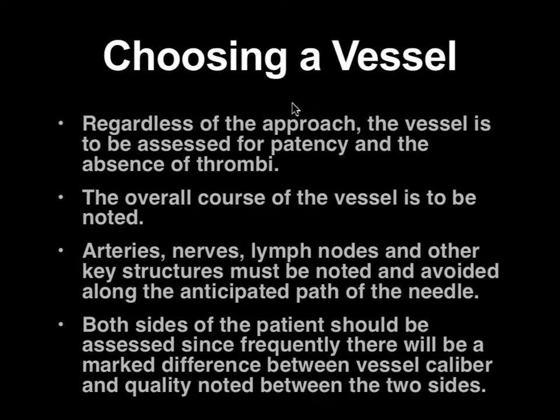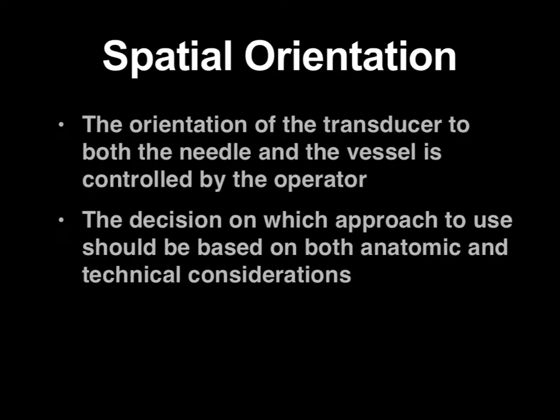Remember, assess both sides of the patient, since frequently there can be a difference in vessel caliber and quality from one side to the other, and don't be afraid to position the patient to see how that affects the relationship of the target vessel to surrounding structures, and see if that makes the approach more doable for you. Let's take a look at spatial orientation. The orientation of the transducer to both the needle and the vessel is going to be controlled by you, the operator. And so the decision on which approach you're going to use should be based on sound anatomic and technical considerations, and that's what we're going to go over here.